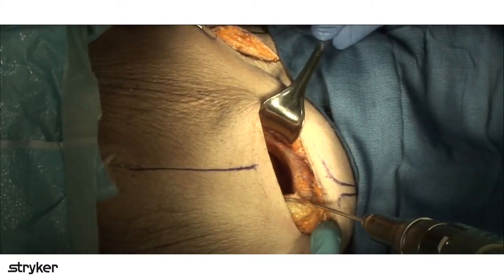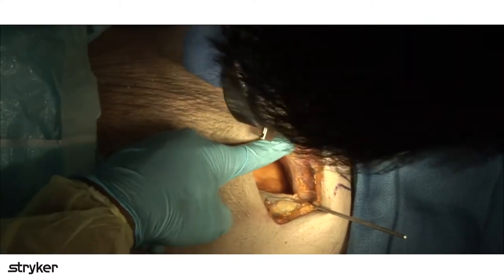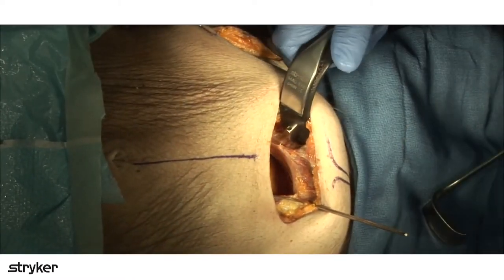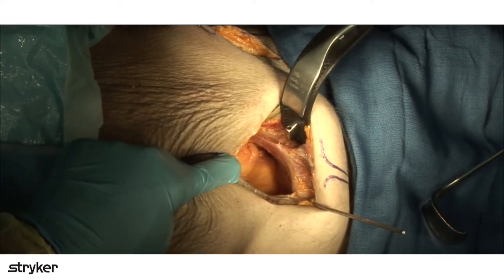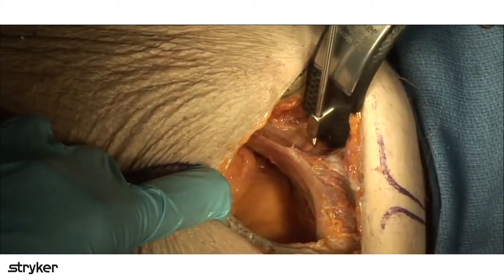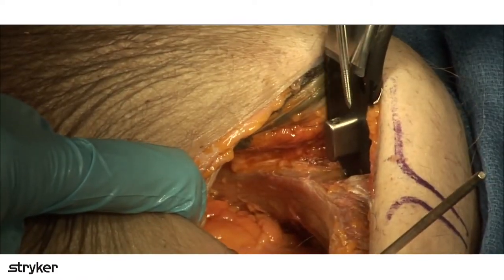Do you want to put our lighted retractor in? Yep. And we're going to put some retractors in here now. So you can use either sharp Hohmann or this retractor number 1 from this set. We have another threaded wire. Yep, I had one up here. I had them both up here. Oh, here it is. Can you zoom in a bit on that, please, Jason? So these wires will just kind of hold the retractor in place.